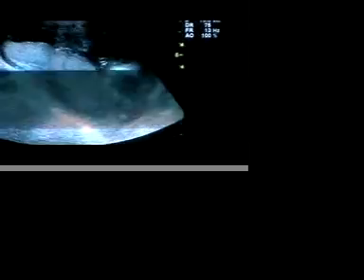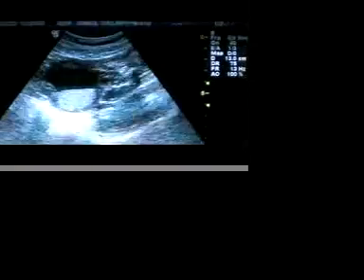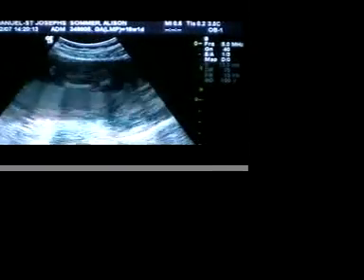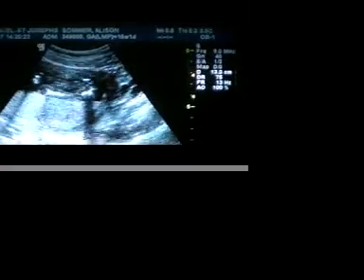So baby's spine is up on this side. Oh, baby's spine's up. Which way are you lying so we can keep track? Body's on the left side of you. One leg right there and one leg right there, that's bottom and bottom. So what I'd like to do is get the baby to kind of pop the legs open there so we can see good. That line there and that line there are the femurs.